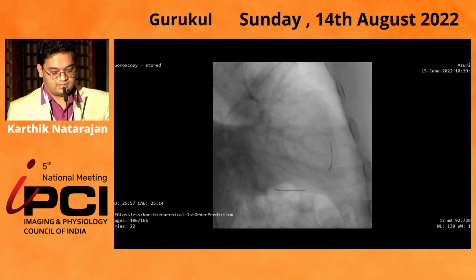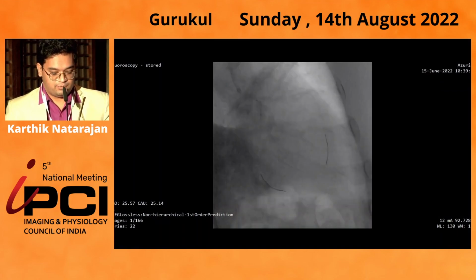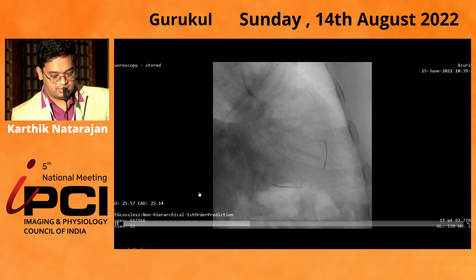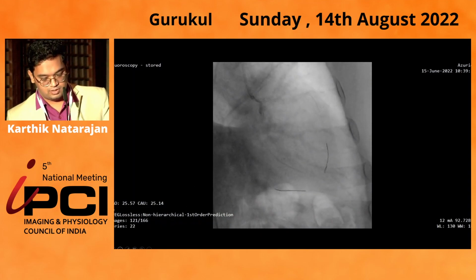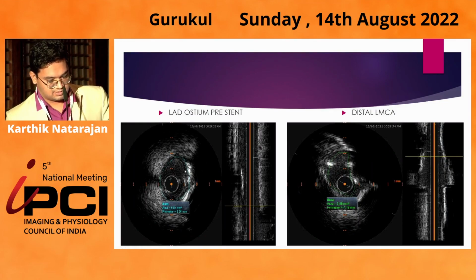We decided to go in with a shockwave balloon, a 3.5 by 12 millimeter. We delivered 30 pulses to the circumflex and then the rest of the pulses to the LAD. We could see a good expansion. I'll just show you the images.